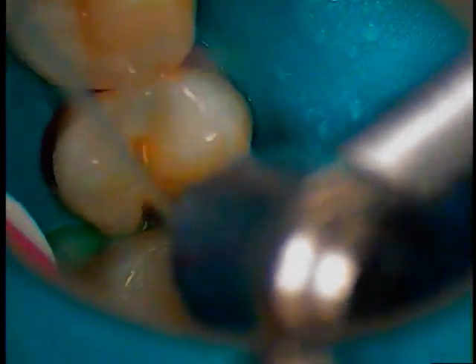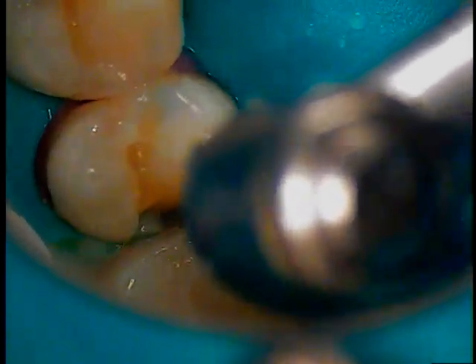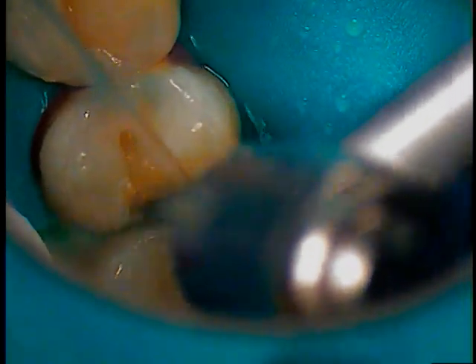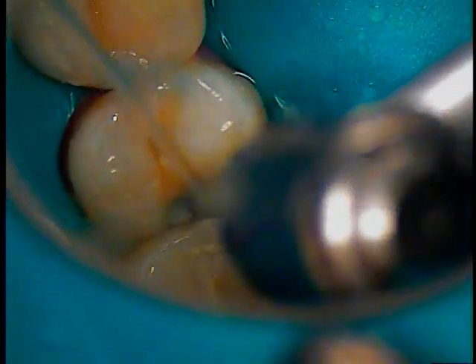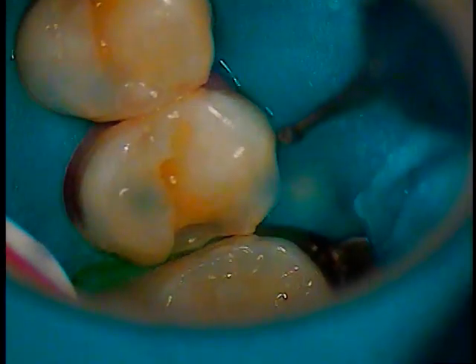I always ask for continuous water because this doesn't shoot water out on a tooth. So, okay, now you see the white stuff's gone, right? That's the hypocalcified areas that everybody says, oh, let's just treat it with fluoride, or let's just treat it with a chemical and see if that'll remineralize. Well, we tried everything, MI paste, you name it. It's into dentin. Air in the mirror.